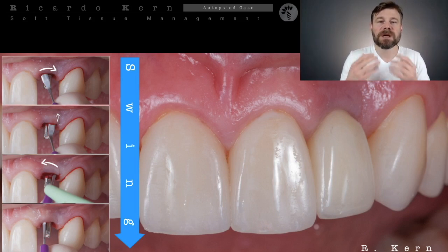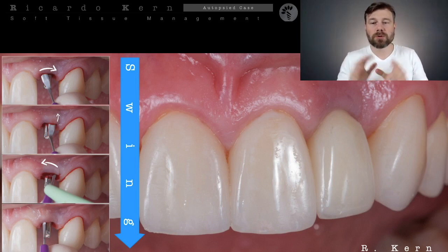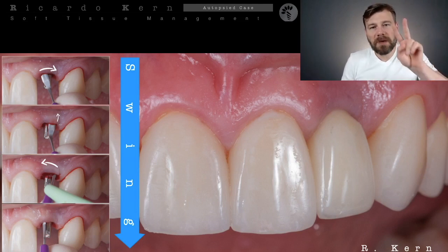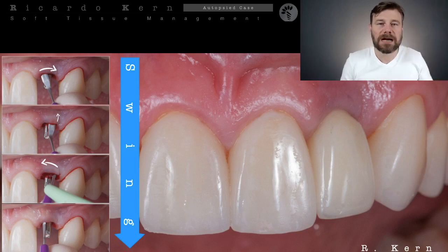And if you decide to approach that or to do this kind of surgery, you're going to have two main options to approach a case like this one, okay? So I'm going to show you some options that you may have to treat a case like this one, right?